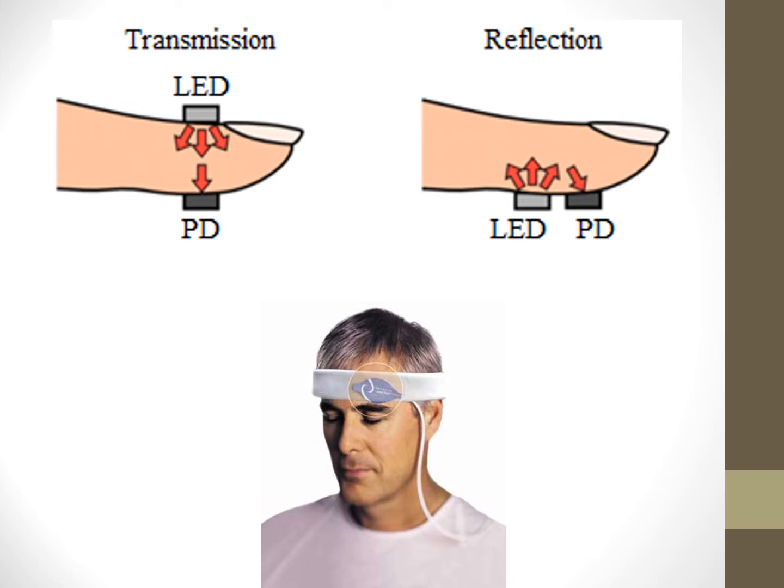Now understand, some people will take these transmission sticker probes and just pull them flat and put them on the forehead. Understand that where the light is transmitting, when you unfold one of those sticker finger probes to put it on their head, the light source and the receiving parts are now way far apart. They're not close together. So you might get a signal.